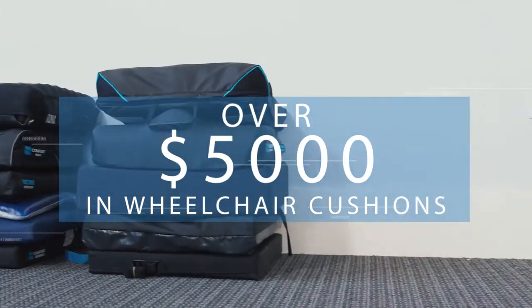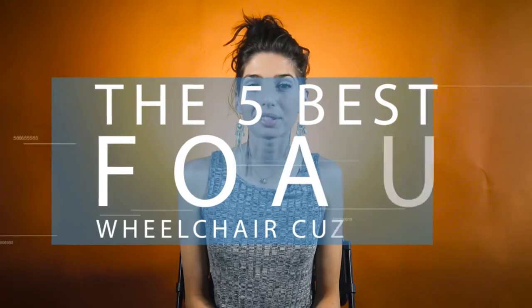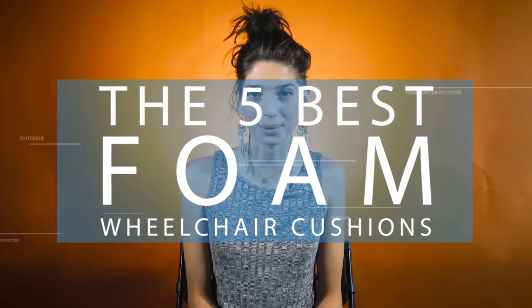Foam wheelchair cushions have come a long way from being featureless, mushy bricks, but it can still be difficult to understand the differences between them. That's why we've put over $5,000 worth of cushions through our 70-point test to whittle them down to the best of the best. These are our picks for the five best wheelchair cushions in the foam category.